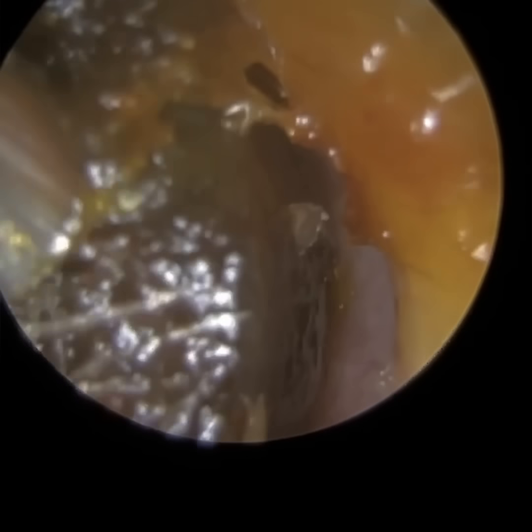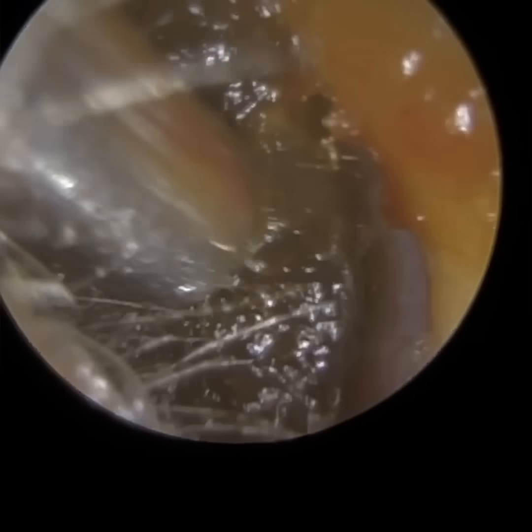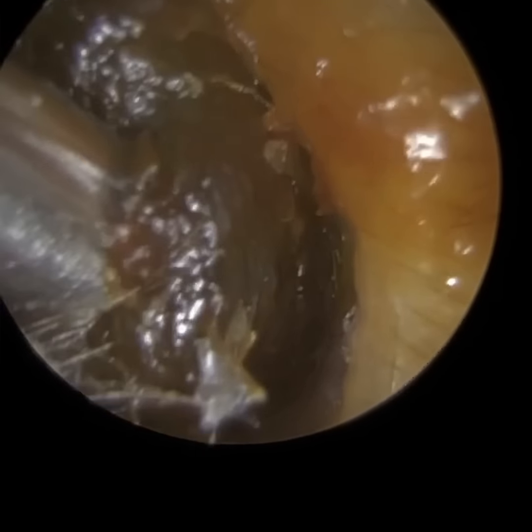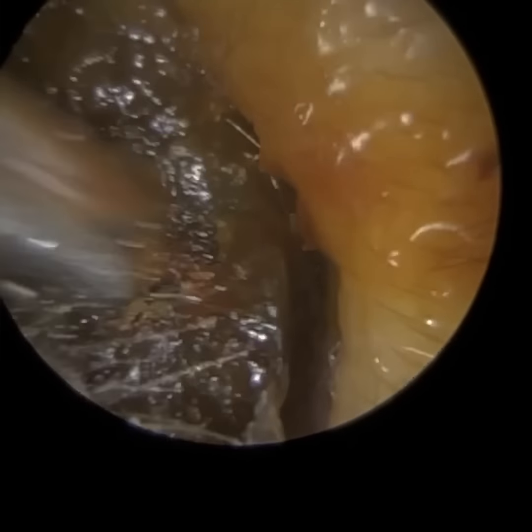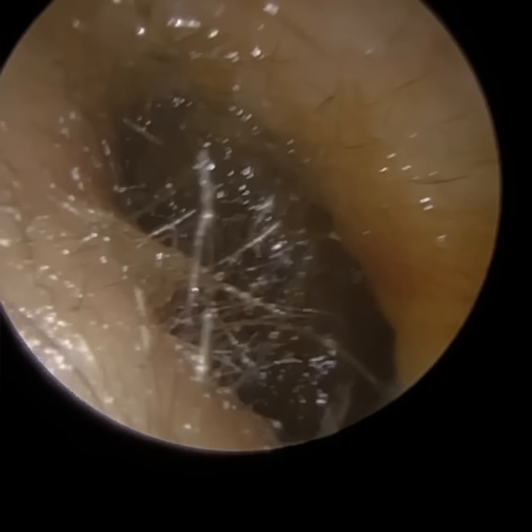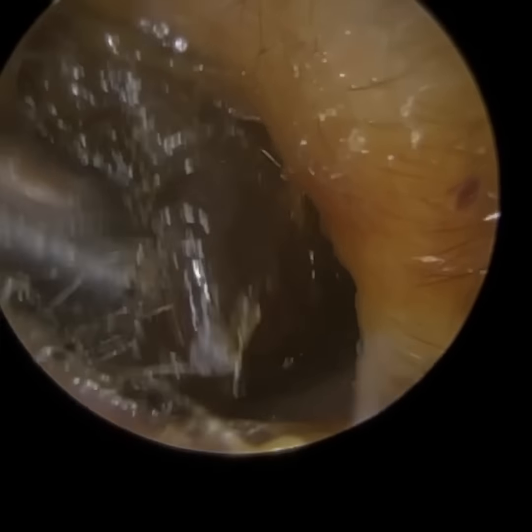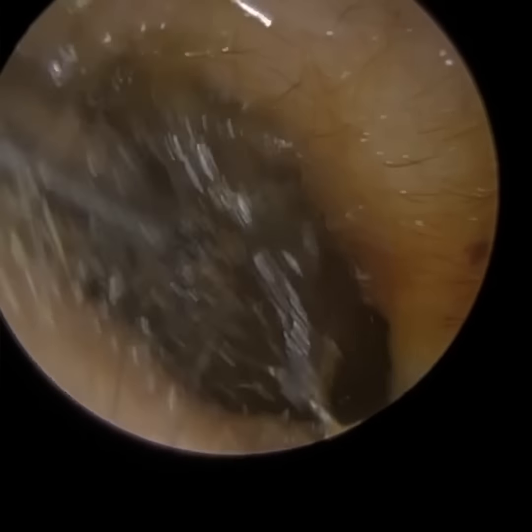You may have just seen those little wriggle movements I deployed with the suction probe. The reason for that — because this wax is quite sticky and soft, if I apply too much pressure with the suction probe against this wax plug, because of the consistency of it, it's very likely going to block the suction probe itself. So when you've got a plug like this, you always want to kiss the surface and hover over without applying too much pressure.